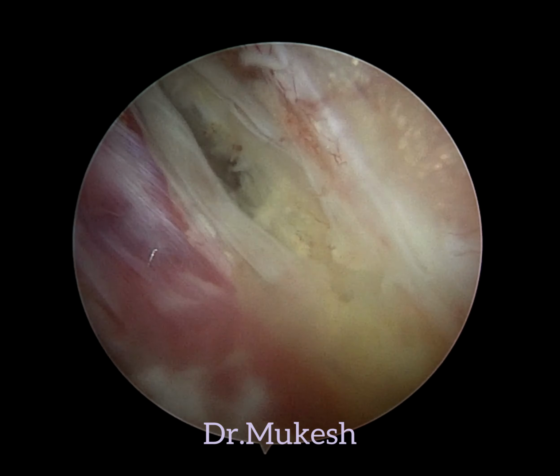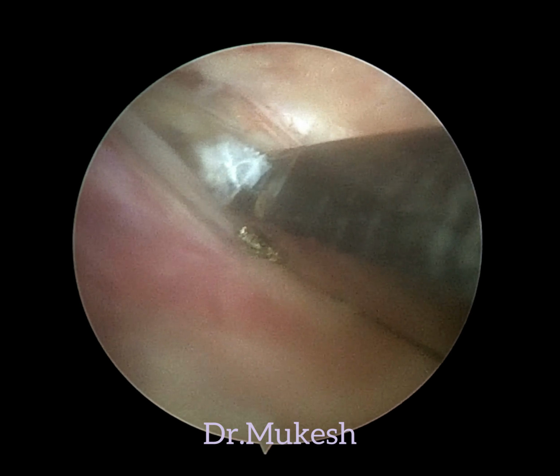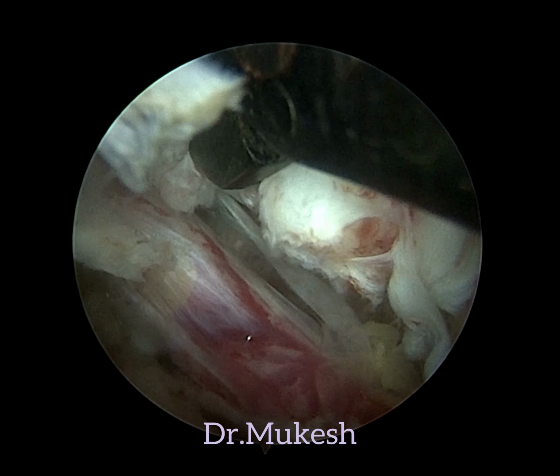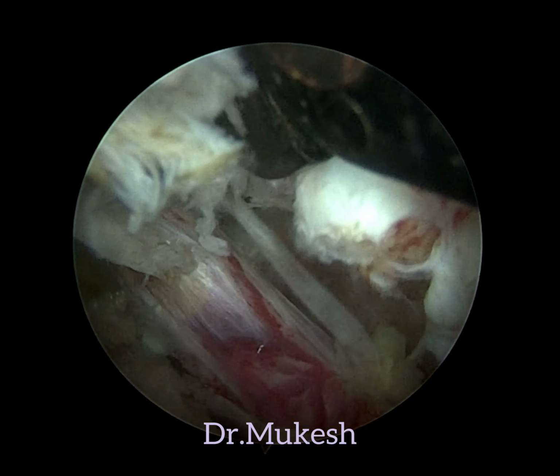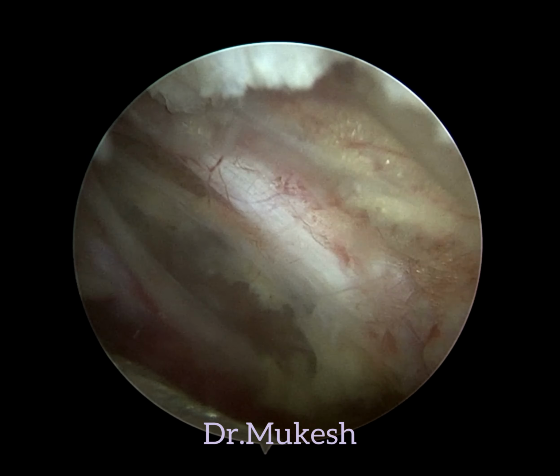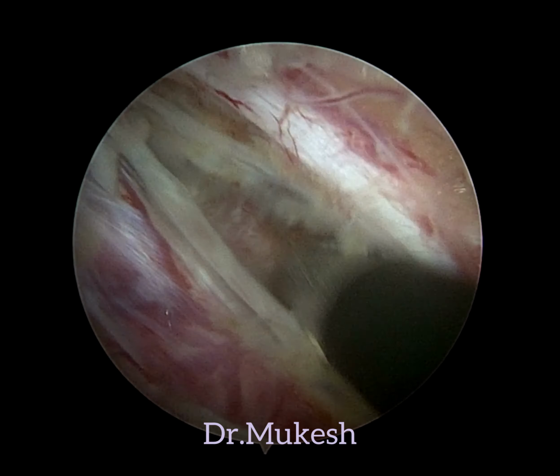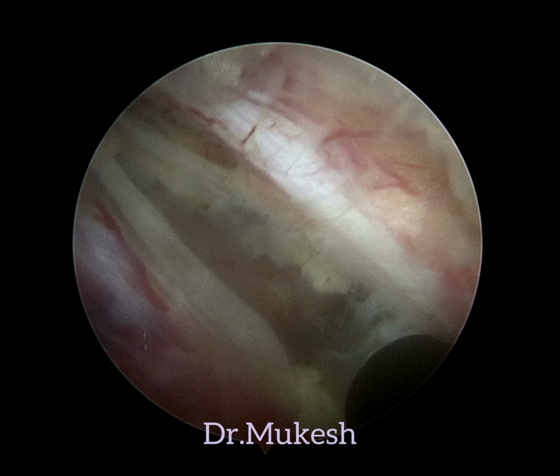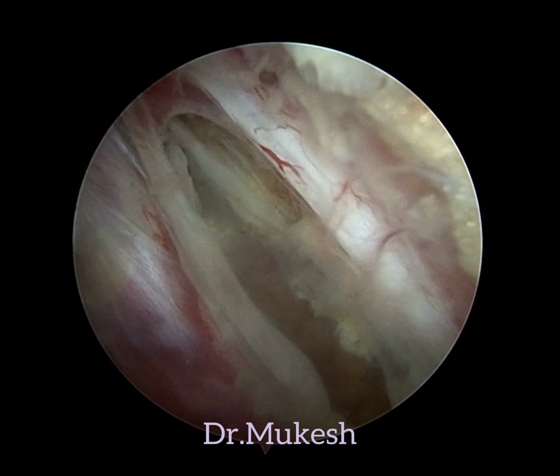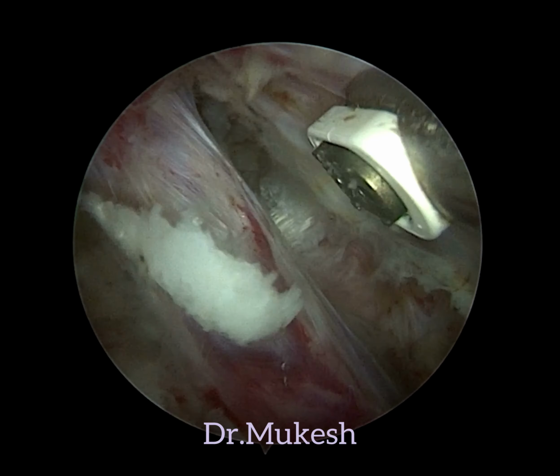So once this large disc fragment, which was caudally migrated, was mobilized, then this was taken out with the help of again this curved disc forceps. So this entire large fragment we were able to take out. So now we can see there is a large defect which was created by this extruded caudally migrated fragment.